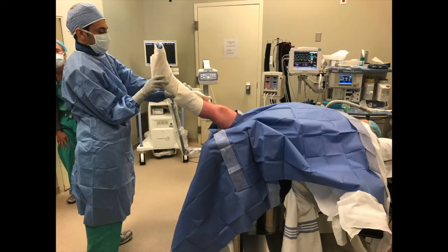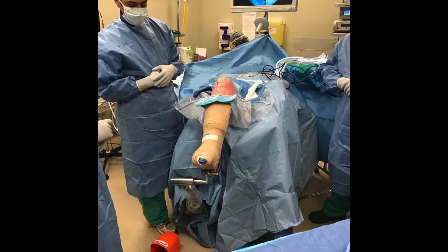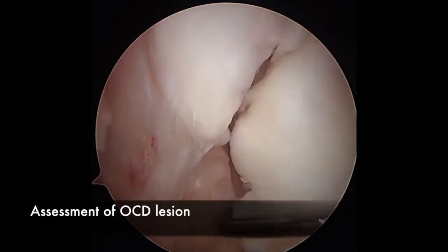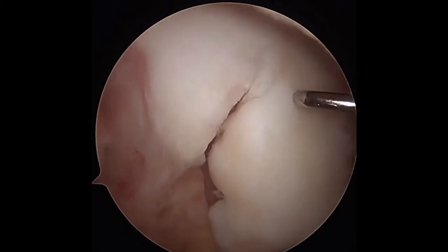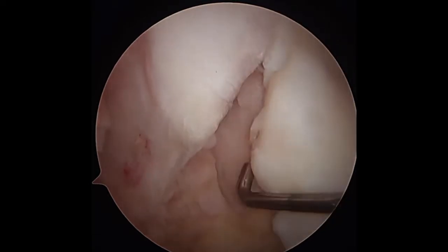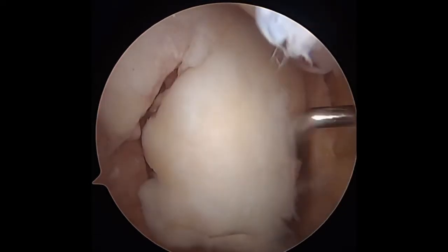The patient is positioned supine with the right foot placed into a spider knee holder. A routine lateral portal is used for diagnostic knee arthroscopy. The OCD lesion was identified with the probe to be loose and unstable and was removed with a grasper.